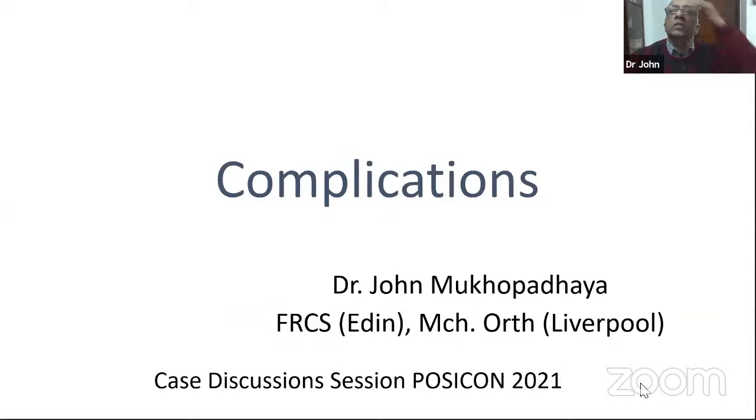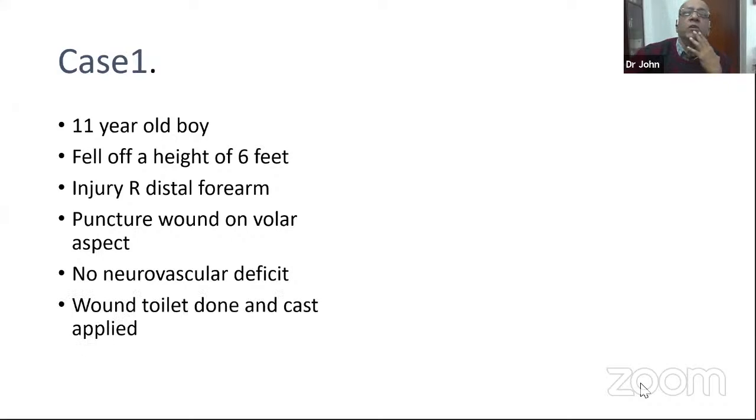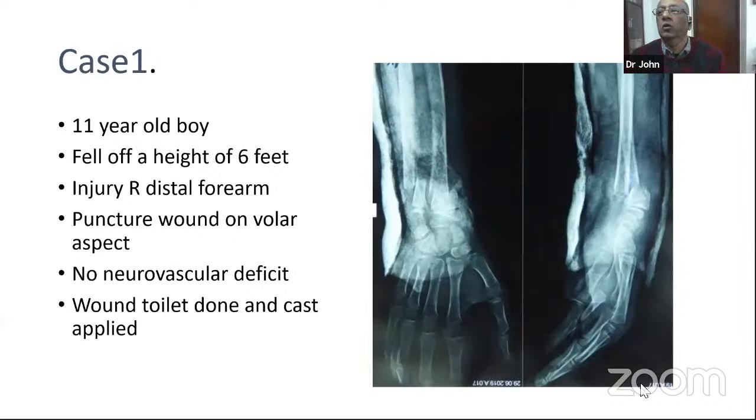Okay, so we'll go on to the next one, which is a trauma case. We're doing alternate. This is an 11-year-old boy who fell off a height of 6 feet. He had injury to his right distal forearm. He had a puncture wound on the volar aspect and no neurovascular deficit. He was taken to an orthopedic surgeon who did a wound toilet, cleaning it out, and put a cast on. And these are the original x-rays post the casting.